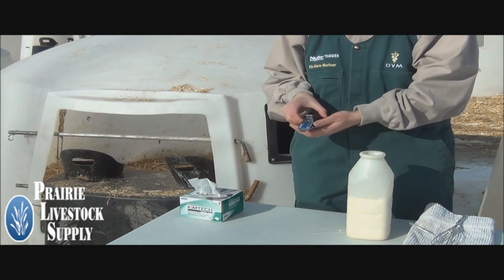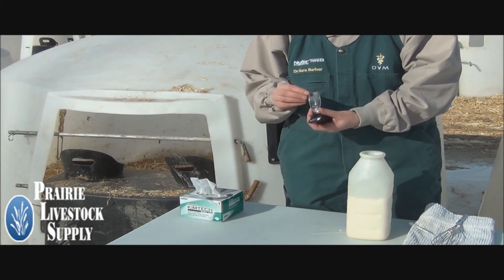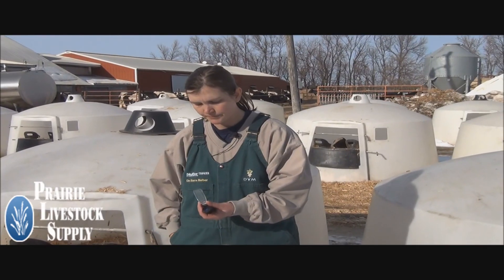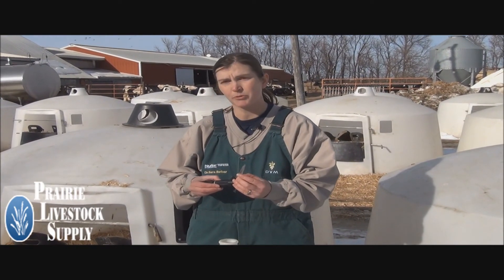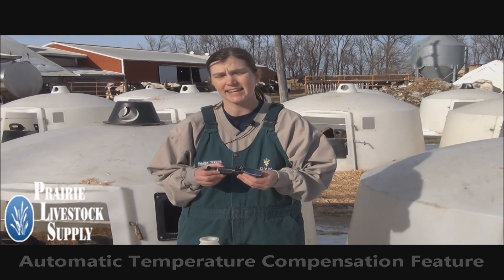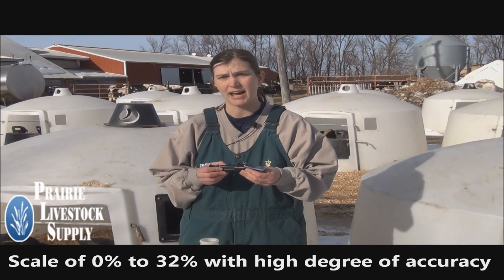To clean the refractometer, just wipe the lens and the flap with a lint-free wipe. It's important to choose a BRICS Refractometer with the automatic temperature compensation feature and that it has a scale of 0 to 32% with a high degree of accuracy.